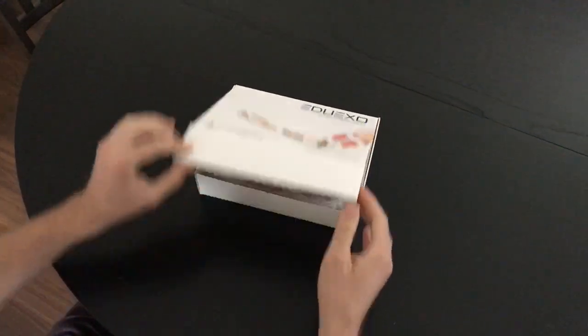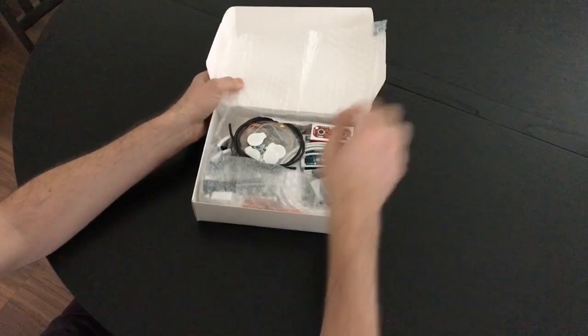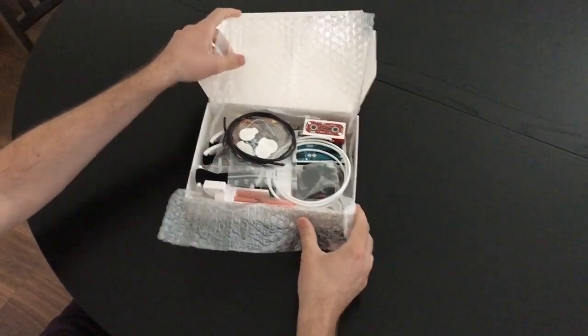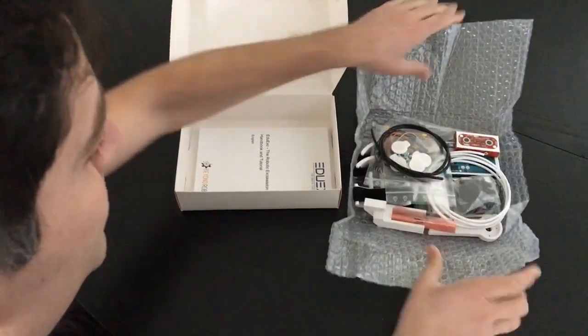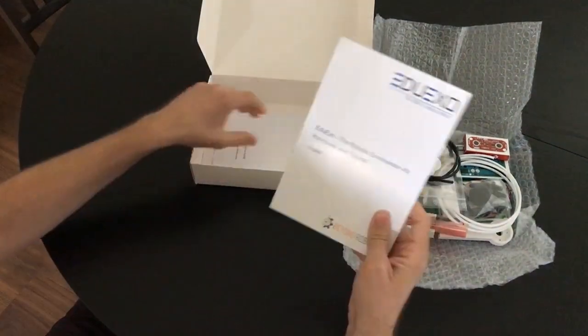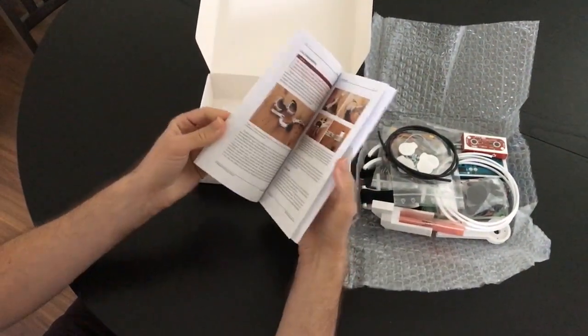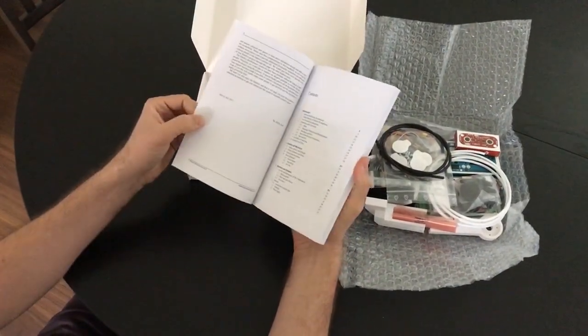Opening it up — we've already opened this one earlier. You will find your controller, cables, and everything you need to build this educational kit. You start up with the booklet, and even though it's a really small thin booklet, it's a very unique piece of literature.